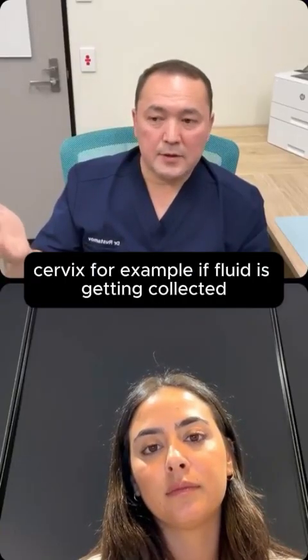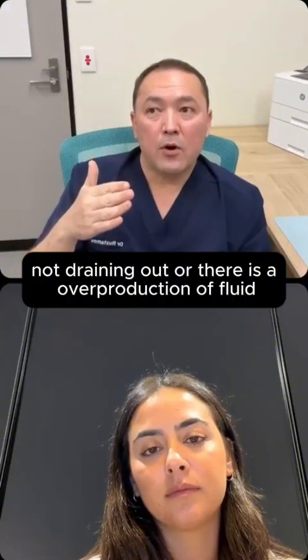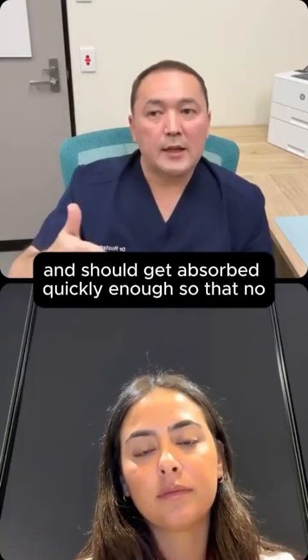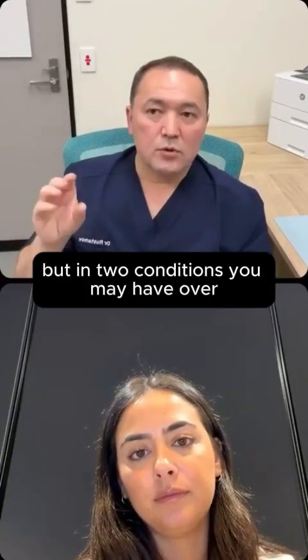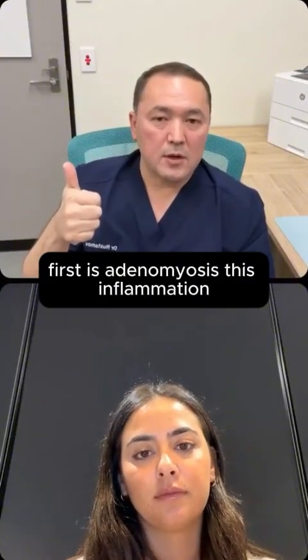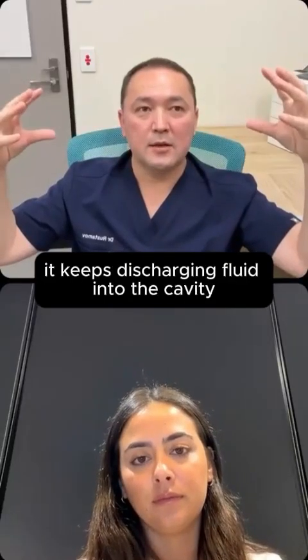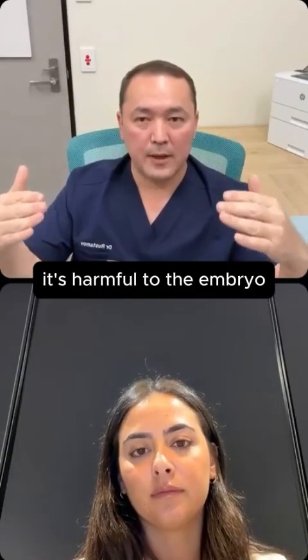stenotic cervix, for example, fluid is getting collected, not draining out, or there is an overproduction of fluid inside the uterus. The endometrium always replenishes with fluid on the surface, and it should get absorbed quickly enough so that you should not see the fluid. But you may have three conditions with this overproduction of fluid. First is adenomyosis. The uterine wall muscle becomes like a sponge, then after the menstrual period it keeps discharging fluid into the cavity. It can get collected. That fluid is inflammatory fluid. It's harmful to the embryo.